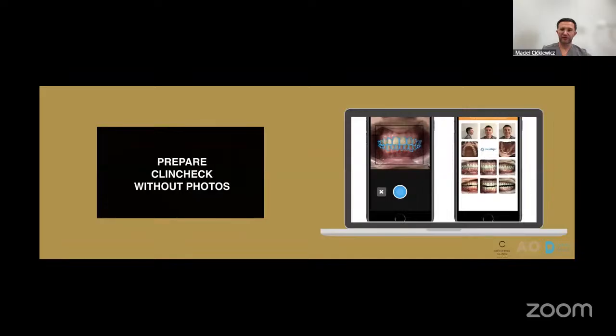But recently I saw that some laboratories changed the form to three elements, so you can put the right side, or the front teeth, or the left side for each element, and the third option like no photos. So this is a good idea for a very short prescription in this direction, so that you can save your time. So this is the option I wanted to have.